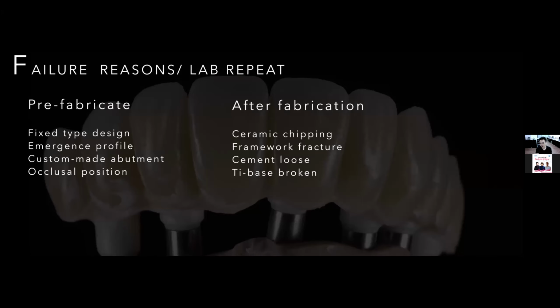And the second problem is more interesting. If your first step is not done very well, you will have a problem after you send the case to your customer, especially once the restoration is cemented or screwed into the patient's mouth.